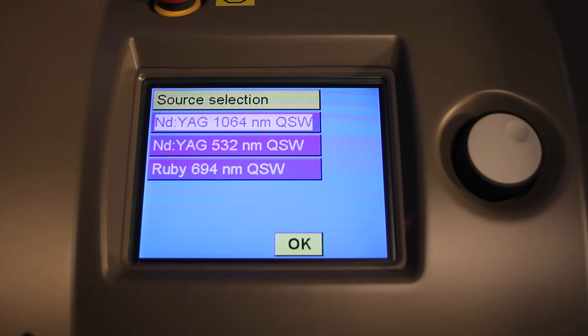The thing that has really separated us is the fact that we have three separate wavelengths: 1064 Q-switch, 532 Q-switch, and the 694 Q-switch, which is able to treat the green and blue inks that traditionally are very difficult to treat when going after tattoos.